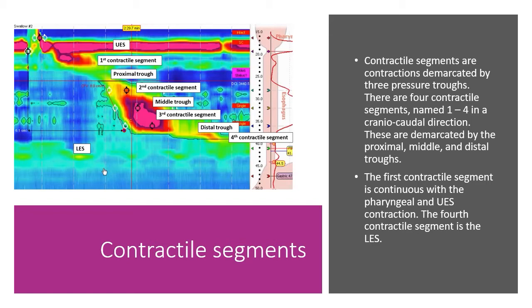The first contractile segment is continuous with the pharyngeal and upper esophageal contraction. The fourth contractile segment is the lower esophageal sphincter.